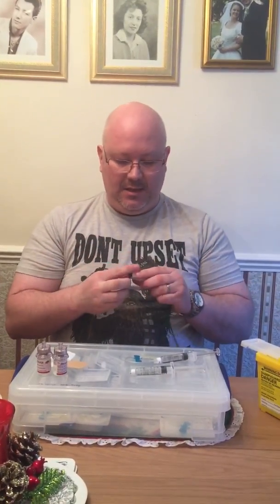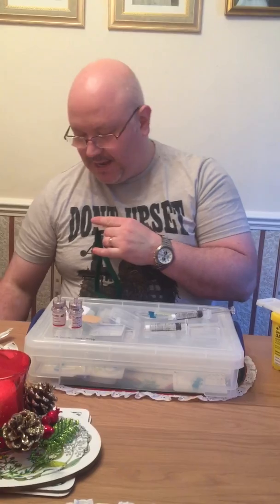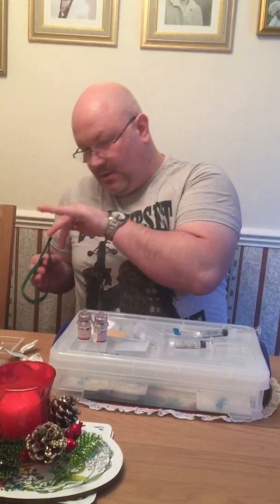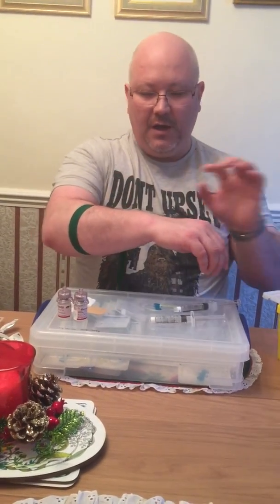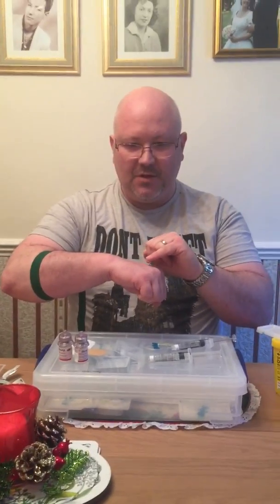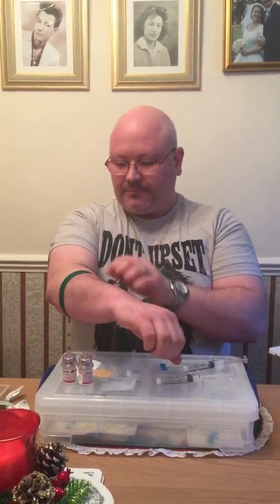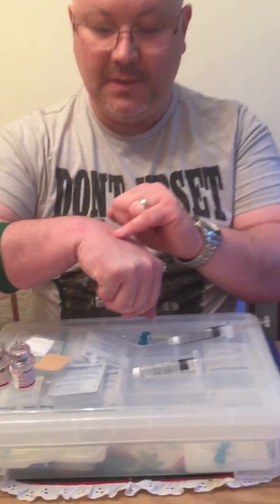Now I prepare the tourniquet — open it up and make a loop. You want as much blood as possible in your vein, so let your hand dangle for a moment to get the blood down. Fit your hand through and pull tight. I want the tourniquet over the arm so it occludes the blood flow, which makes the vein stand up quite nicely. Wait for the veins to stand up — now that's a bit too high up because I've got a lot of muscle mass there. I want to be able to get the veins, and as you can see the veins are starting to stand up.